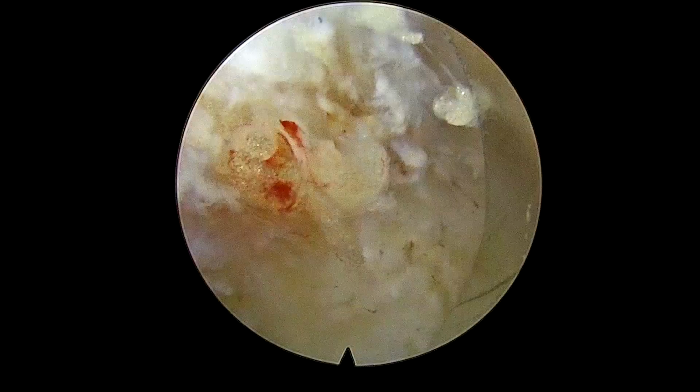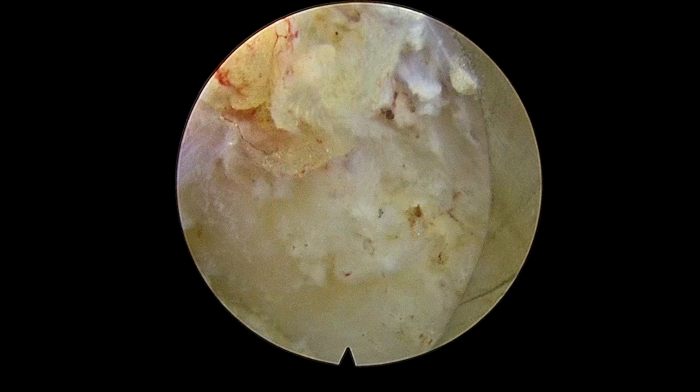Here what I am doing, I'm trying to remove the ligamentum flavum layer by layer with the help of the annular cutter.